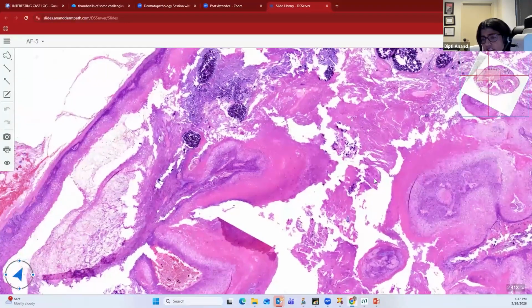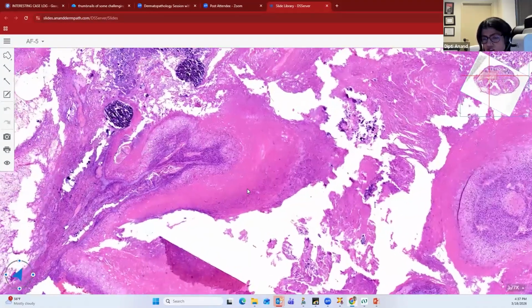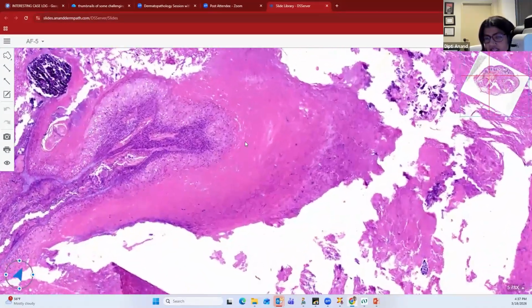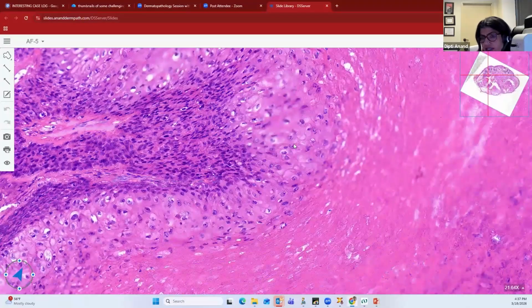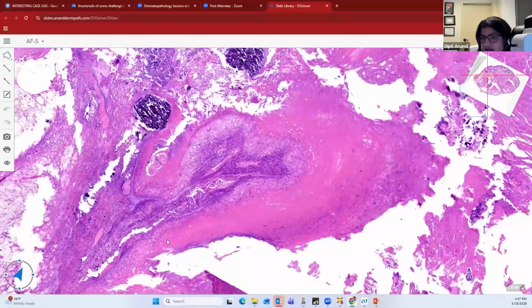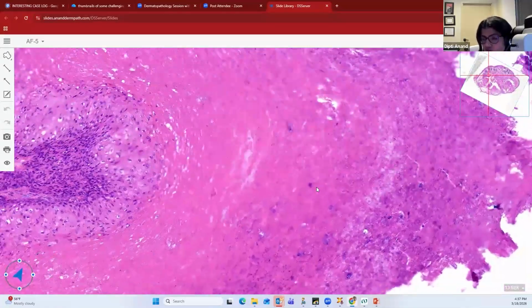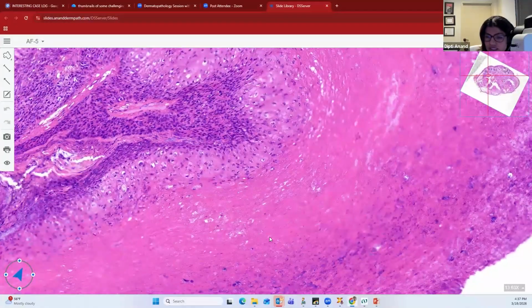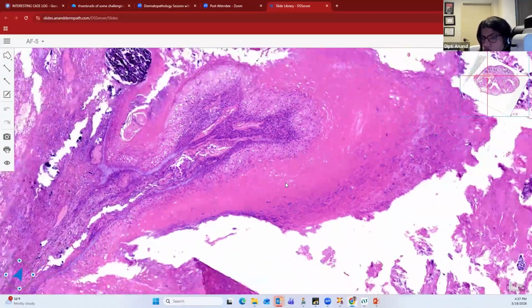You can see that the wall of the cyst has proliferated, and it is nicely showing the trichilemmal keratinization, which is again keratinization through the absence of a granular cell layer with these lining abundant pink cells. The reason I said that this can mimic a pilomatrical tumor is because if you just go directly into the tumor and start looking at the keratin areas, you may start imagining shadow or ghost cells.